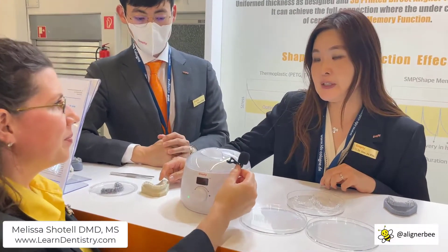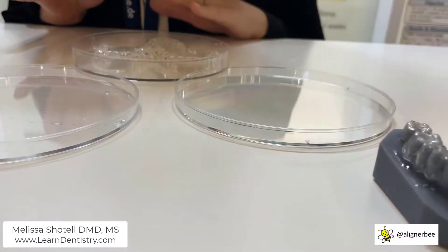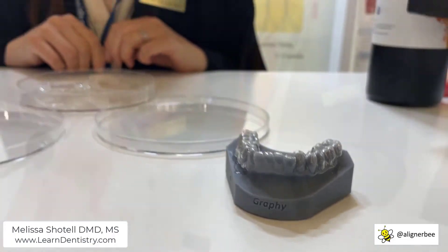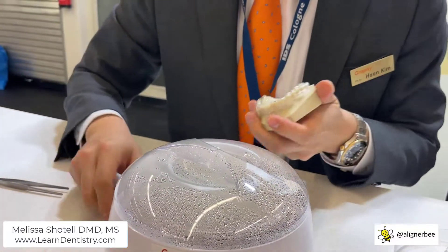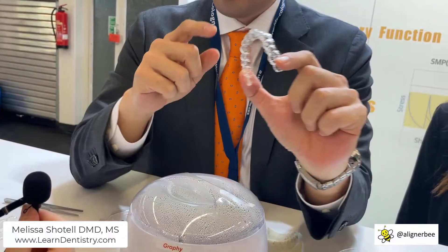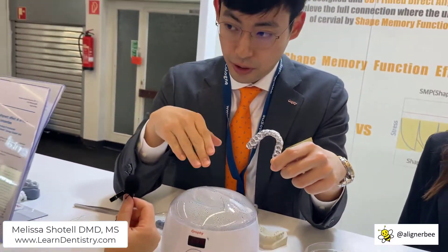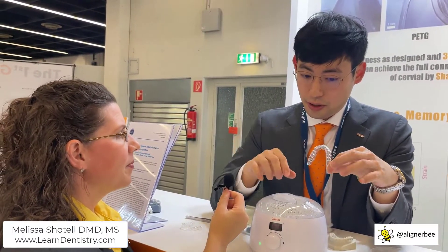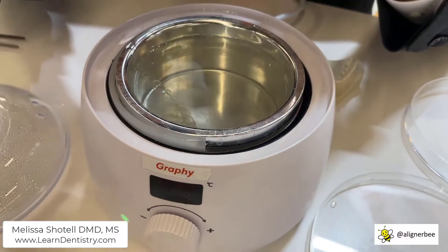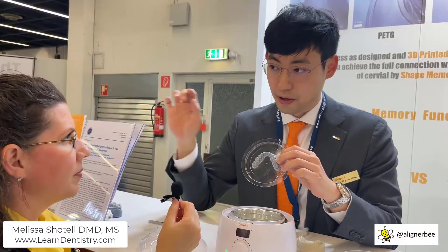Due to the shape memory function and the direct printing from digital setup to the aligner, you can see there's an undercut area and we don't need to block out these areas. Thanks to the shape memory function, we can also change the thickness, and that's how the precision and accuracy comes from. Our aligner looks similar to conventional aligners and feels similar, but it's totally different from the chemical structure. This is the conventional PETG. PETG has a linear structure of the polymer, just like a fiber — fibers entangled together.